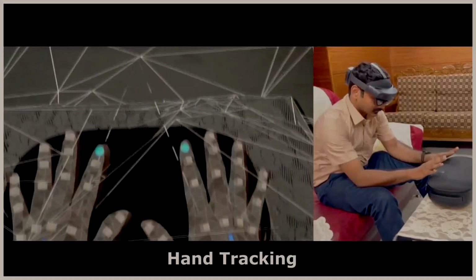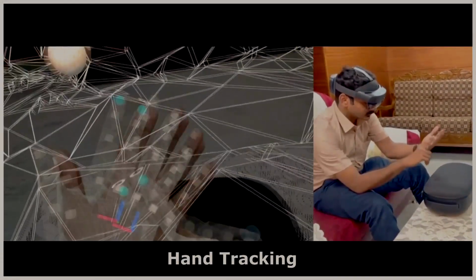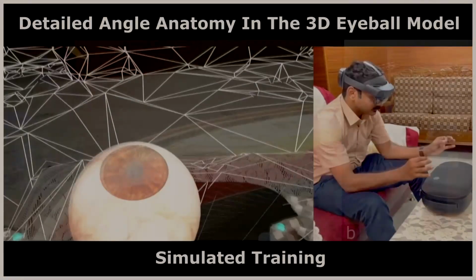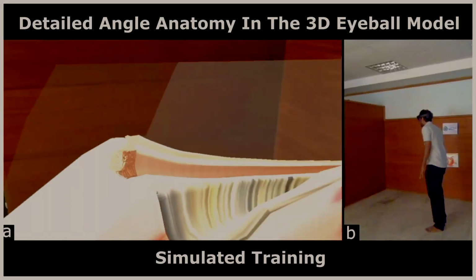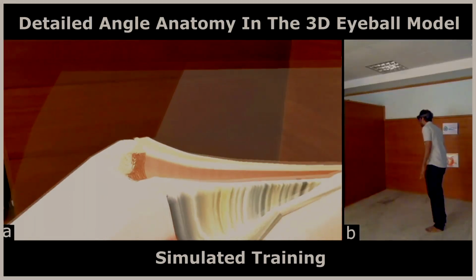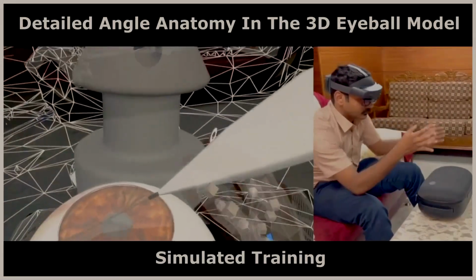Dr. Pavitra, my associate, is there. People who are interested, we are always there to show you this. The love of MIGS took us further. Everyone was focusing on simulators for cataract, so we wanted to make something for MIGS because we wanted a more affordable, portable and cost-effective training module, as you can see.